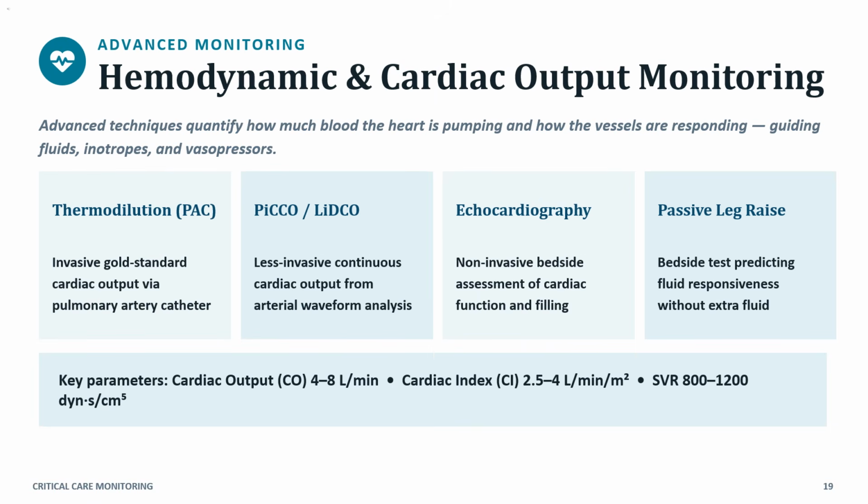Advanced monitoring. Hemodynamic and cardiac output monitoring. Advanced techniques quantify how much blood the heart is pumping and how the vessels are responding. This helps guide fluids, inotropes, and vasopressors in critically ill patients.